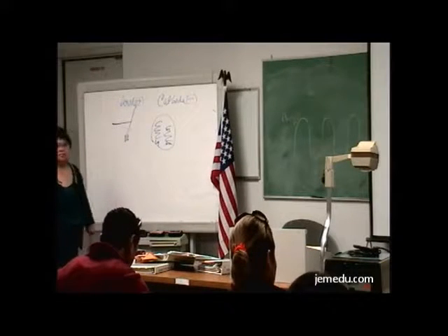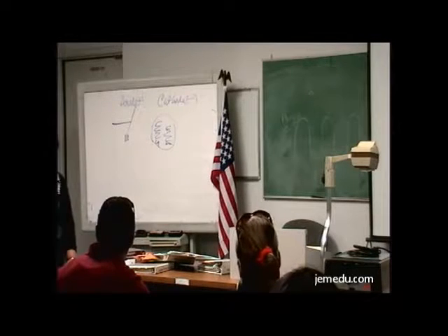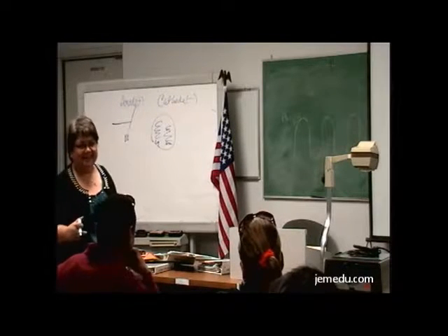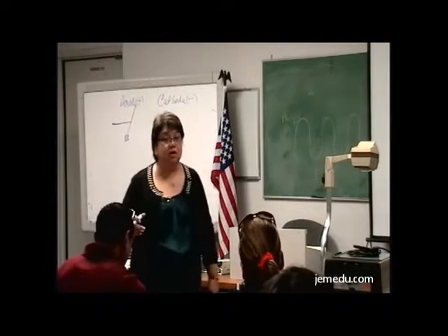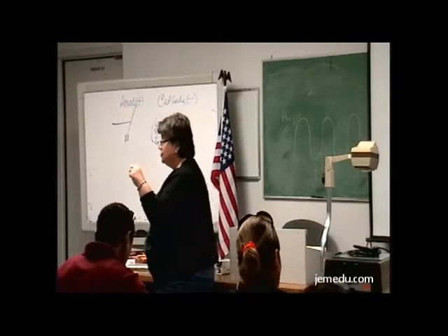And we have how many focal spots? One or two? We're rotating anode. Two? Yeah, we have two because we have large and small, right? So the small is going to cover a smaller surface area. The large is going to cover a larger surface area.